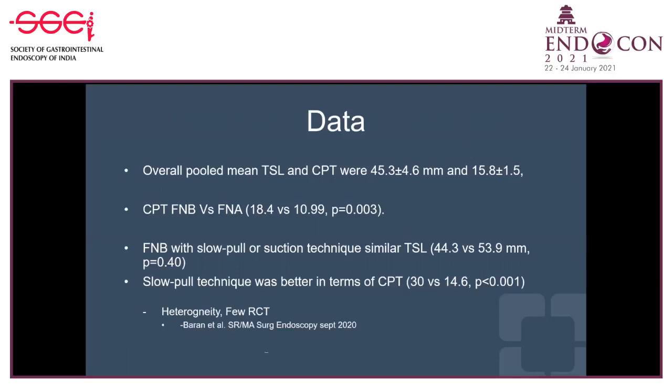I extract the specimen using the stylet back in. Rarely, if I've used a wet suction, I would use a saline to expel the specimen out. I don't use heparin. I try to prevent the fragmentation. We don't shake the jar, and we basically label it as handle with care to prevent fragmentation.